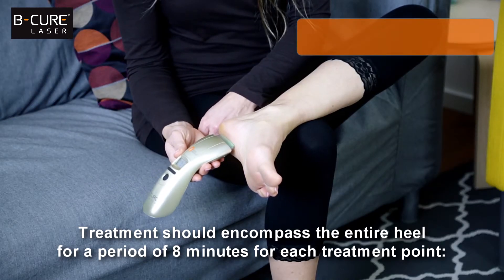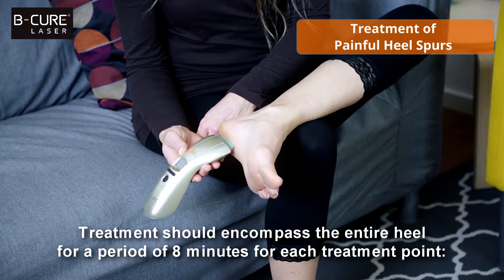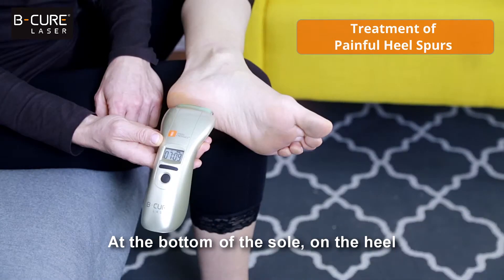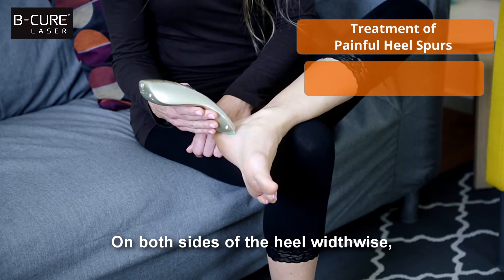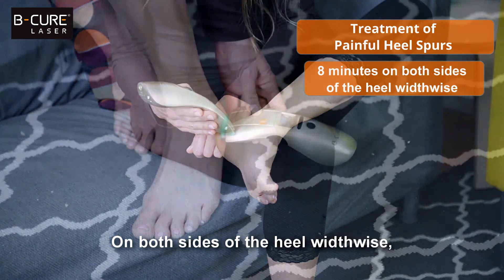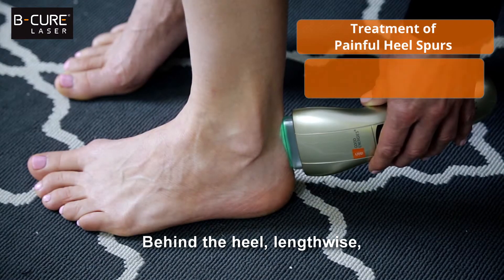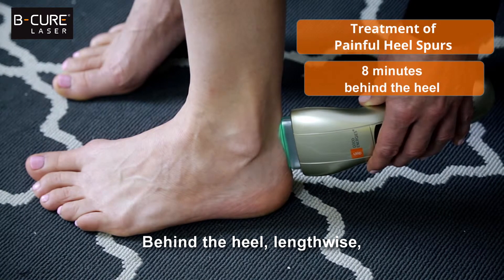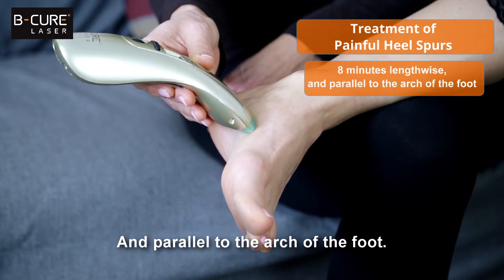Treatment should encompass the entire heel for a period of eight minutes for each treatment point: at the bottom of the sole on the heel, on both sides of the heel width-wise, behind the heel length-wise, and parallel to the arch of the foot.